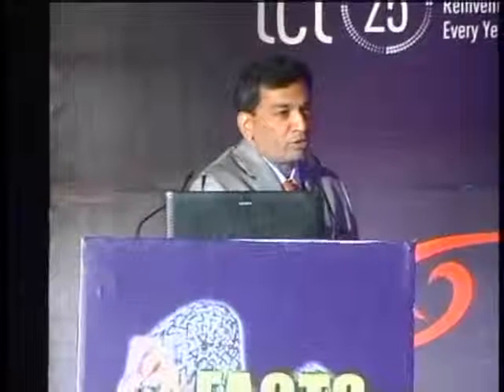At the meetings and also TCT this year, from talking around with Dr. Colombo and others who've been extensively using atherectomy and other devices, I don't think anybody else has attempted Silverhawk. So my experience is the only experience. What's the size of the device which you use for coronary? Size of the device? Sorry for my voice.